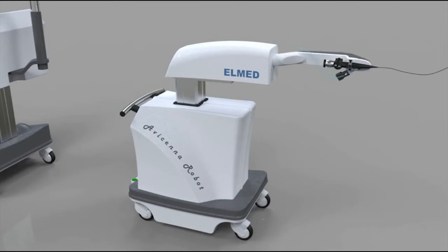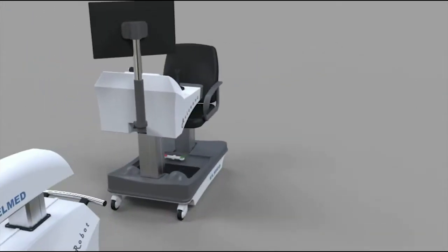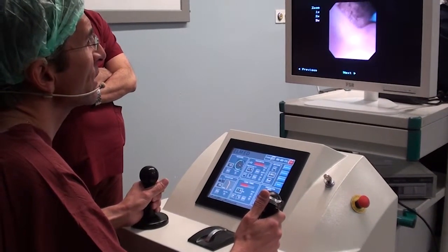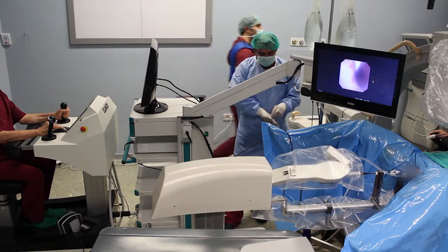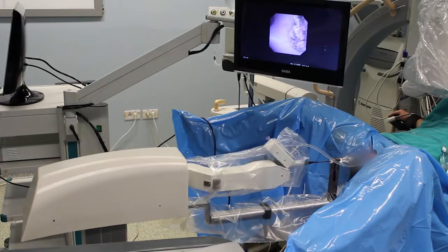The Avicina Roboflex should significantly reduce fatigue and shorten the learning curve of the procedure. We aim to use this robotic manipulator to pulverize the stone precisely and to treat even larger renal calculi, all the while the surgeon sits in the ergonomic chair, out of radiation danger.